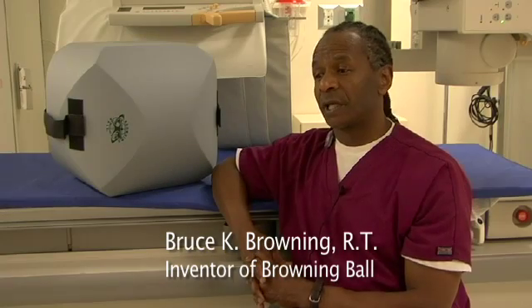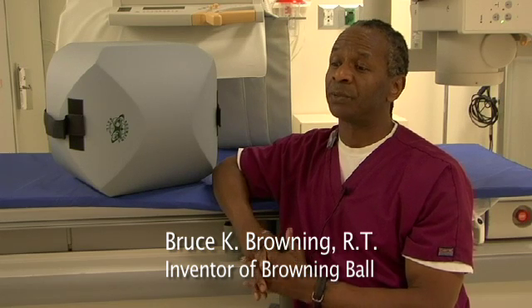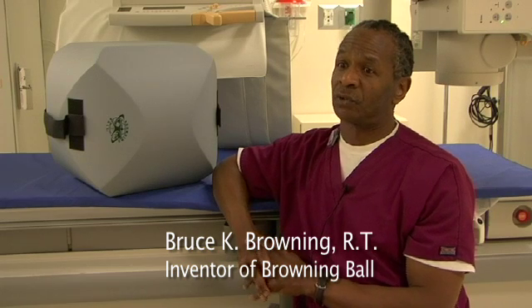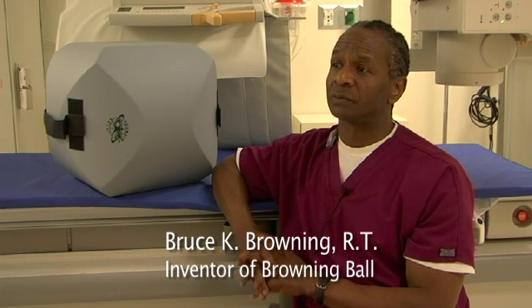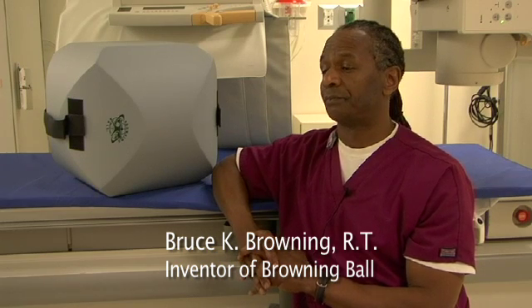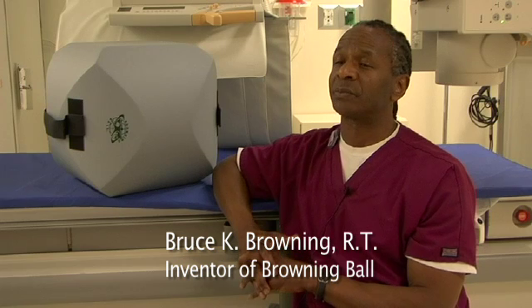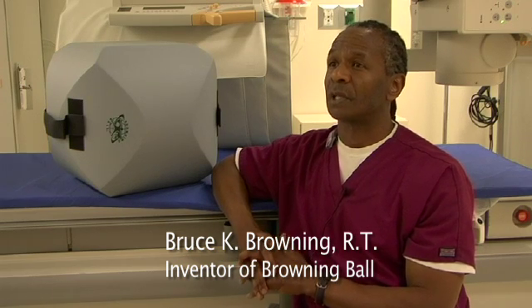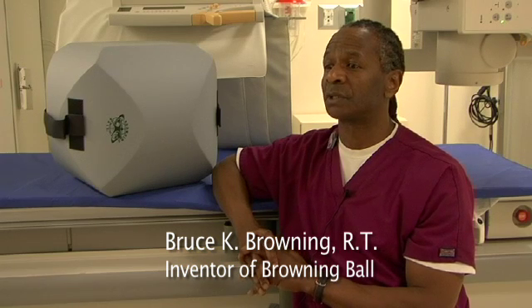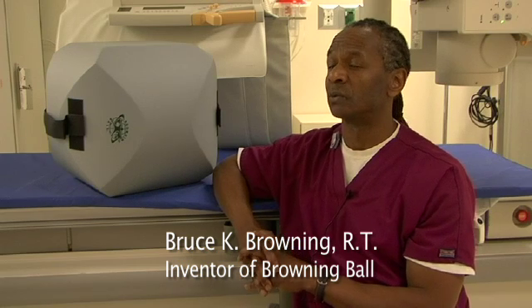The people who benefit from the ball are mainly three groups. One is the radiologist — the doctor that reads the films — because now you have a clear image. The second group are the pediatric patients. You give them this ball when they go into the room and it's like a security blanket; it just helps them be less fearful of going in the room.